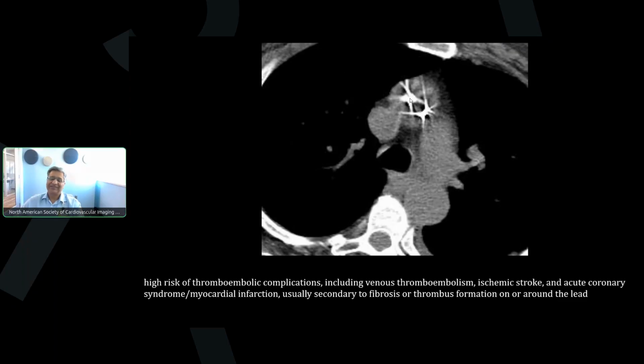The first lead was near the aortic valve, and the second lead was actually in the LV apex. I think the key thing is to identify these, or suspect these, on radiographs, and if the index is high, get a non-contrast CT for confirming this finding. These need to be taken out. We'll see how the imaging evolves in these patients with these left-sided device implantations.